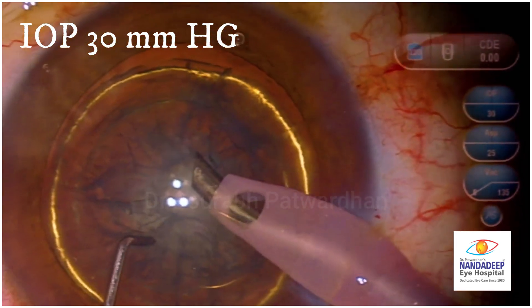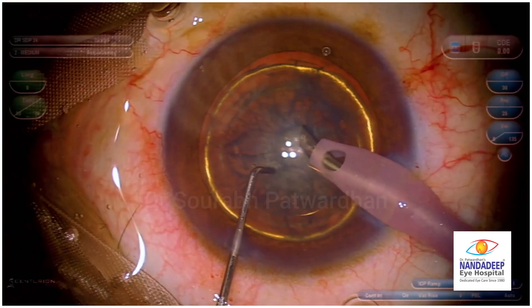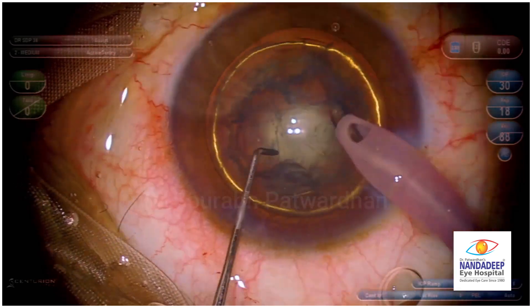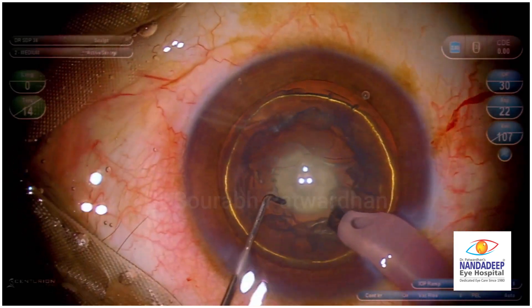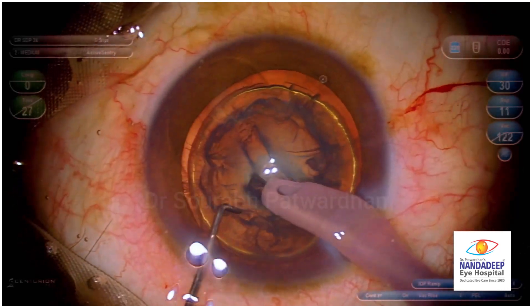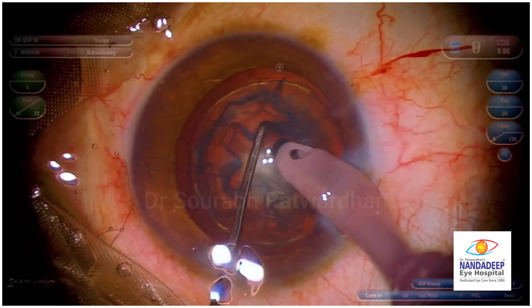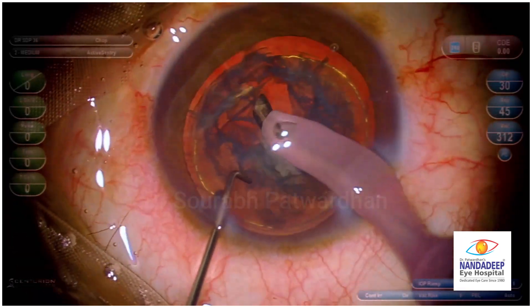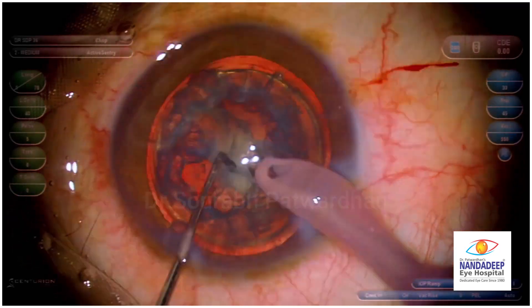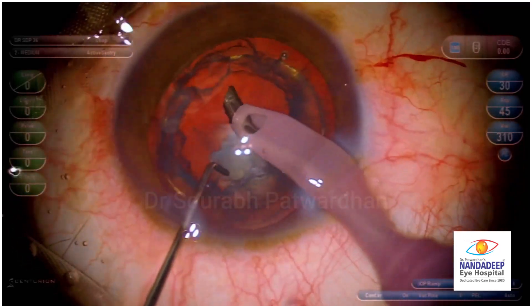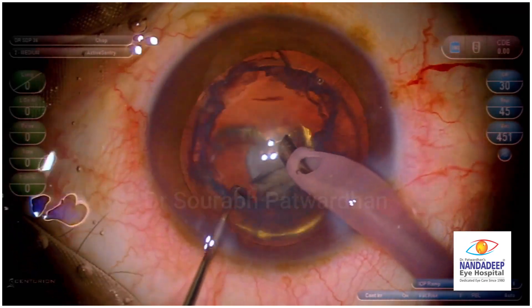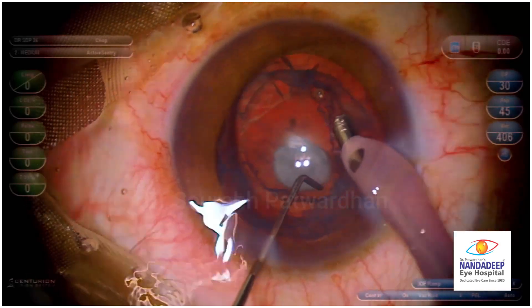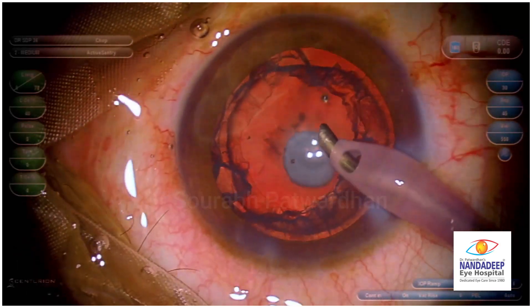I am going to keep only 30 mmHg IOP throughout the procedure. I am using the Centurion system here where I can control the IOP. The nucleus part is not very difficult — it is a softer cataract though the patient is around 45 years old, there is not much nucleus sclerosis. So I did 4 quadrants using the sideways trenching method that I have described for posterior polar cataract, and then just pulled the central very soft nucleus inside and aspirated it.